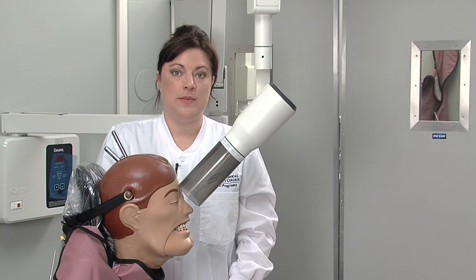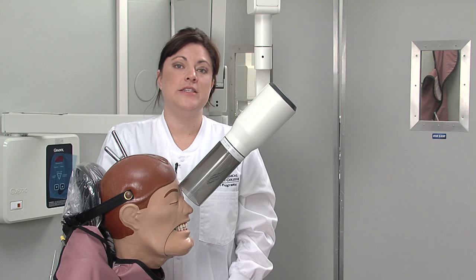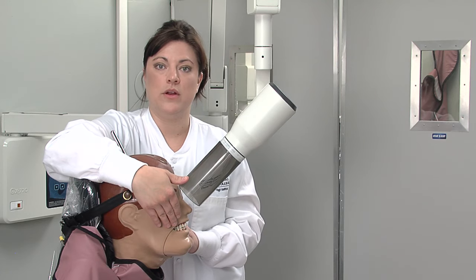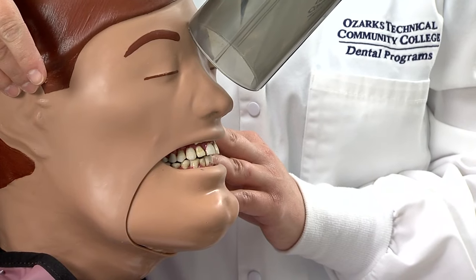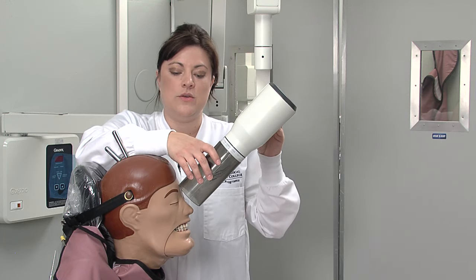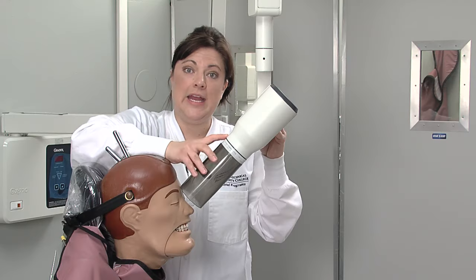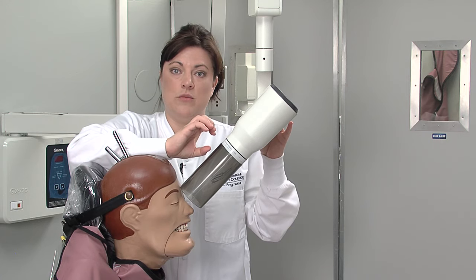To demonstrate PID placement using the bisecting technique, you want to make sure your patient is positioned correctly. When starting on the maxillary arch, we need to make sure the maxillary occlusal plane is parallel to the floor. For all of the maxillary projections, we're basically going to be traveling along the ala-tragus line. Starting with the maxillary central incisors, we're going to use a positive 50-degree angle and line up the PID approximately at the bottom, right around the nostrils. You want to make sure the circle of the PID covers the film to avoid cone cut.